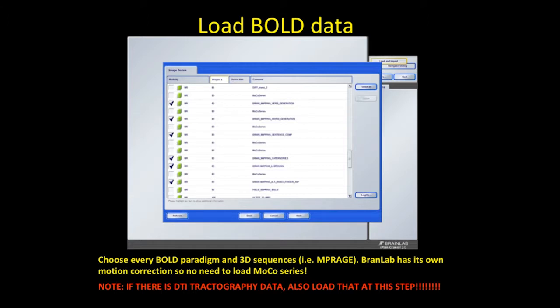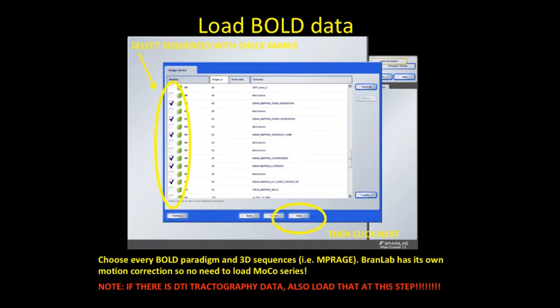Brain Lab has its own motion correction, so you don't need to load your MoCo series if you obtain those. Also, if you want to superimpose tractography data — your DTI tensor data — this is the step where you would click on that as well. Select everything with check marks and hit next.